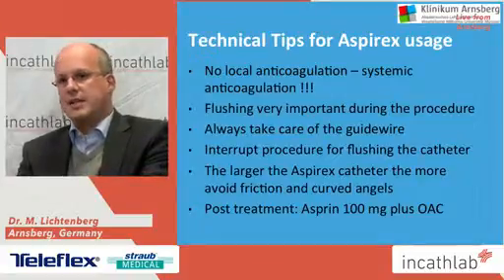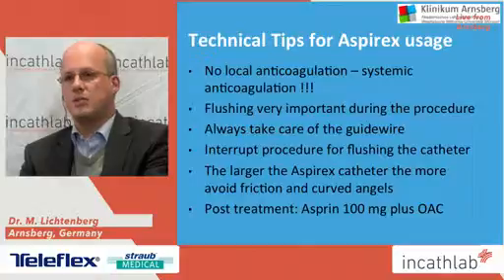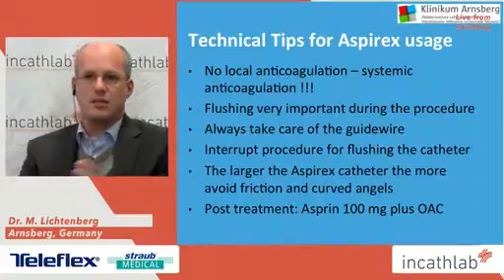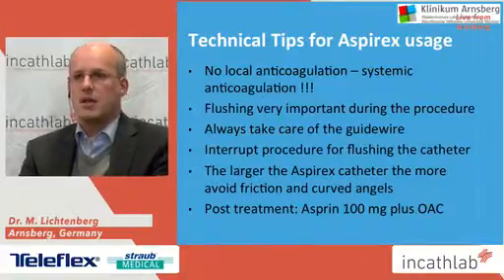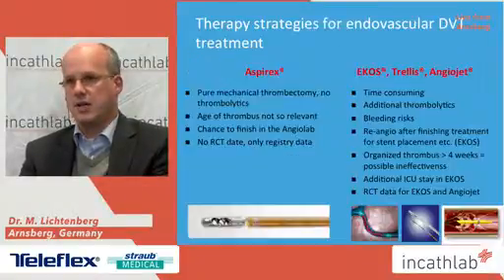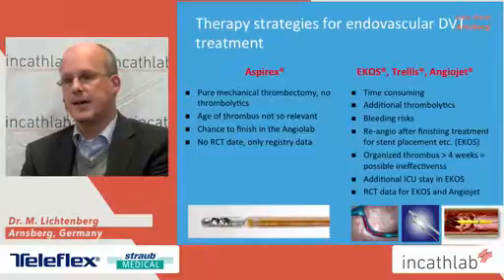So these are the technical tips for the usage of the Aspirex. Please use systemic anticoagulation, no local anticoagulation through the sheath. Flushing is very important, the same as in the Rotarex procedures. Always take care of the guide wire. Interrupt the procedure, as Ralph already mentioned, for flushing the catheter. This is even more important in the vein system. The larger the Aspirex catheter is, the more you should avoid friction and curved angles, especially with the 10F. And we treat these patients afterwards with aspirin and anticoagulation, which is due to the guidelines we already discussed.